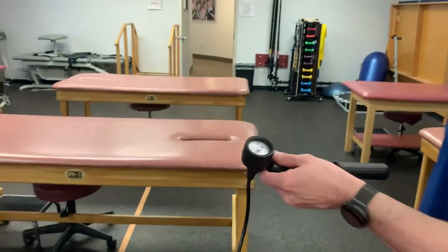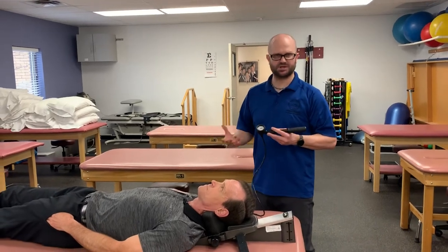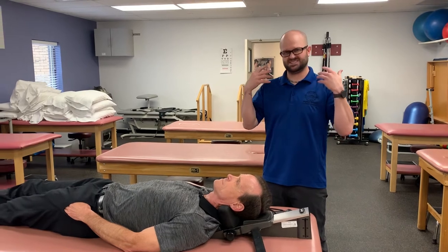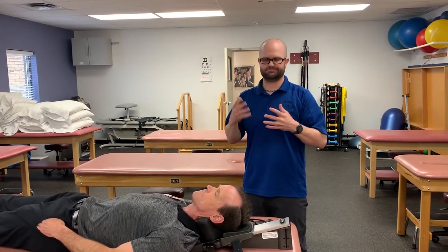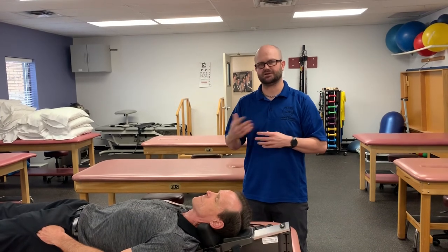As soon as the treatment time is finished, we'll quickly go to release and release all that pressure for the patient. With cervical traction — like everything else we've talked about cervical — it's a sensitive area, so be aware of that especially post-treatment. You may want to let your patient lie there for a little bit and return to normal. Help them sit up so they're not dizzy when they stand and possibly fall. Lumbar you don't have to worry about it quite as much, but for cervical definitely make sure you're paying attention to how your patient is reacting to the treatment.